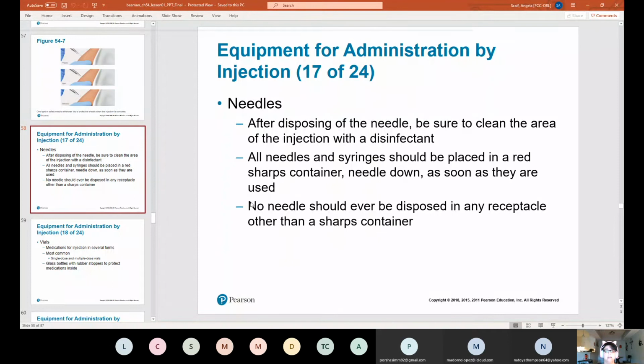That appropriate container is the large plastic biohazard boxes that are designed to be puncture proof. They come in different sizes and shapes. I've seen little round ones, little boxes, big boxes. There's even the big, massive needle disposals.